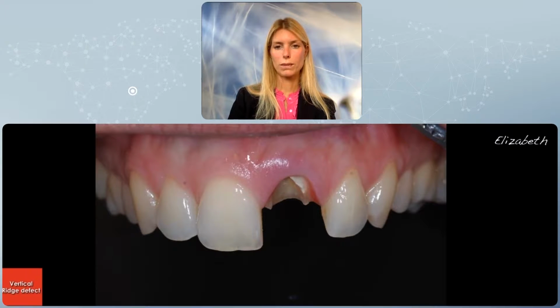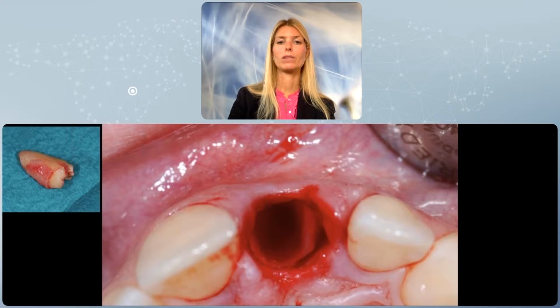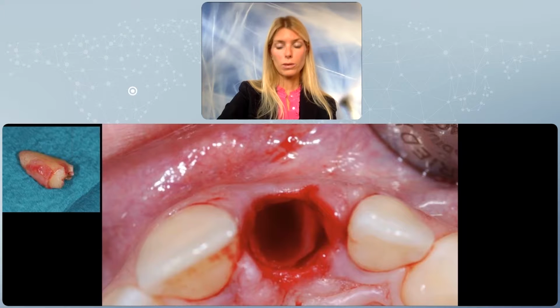If I had performed an immediate implant, the risk of a buccal recession would have been extremely high. And I do not like taking risks. When the tooth was extracted in a very atraumatic way, the buccal portion was ankylosed to the cortical buccal wall, and almost 3/4 of the root was covered by the buccal bone, which meant that the alveolar socket was now left with only 3 walls instead of 4.